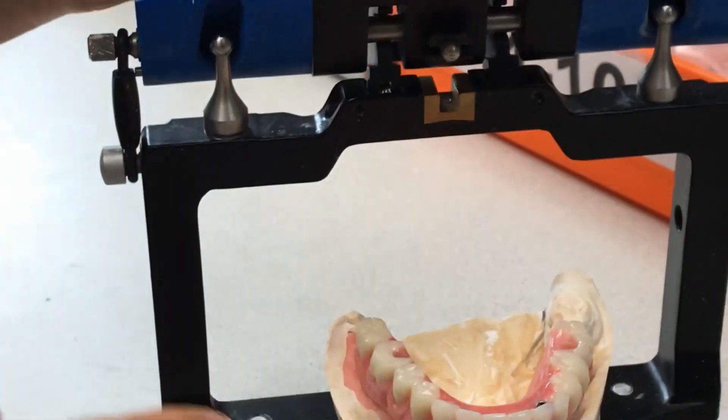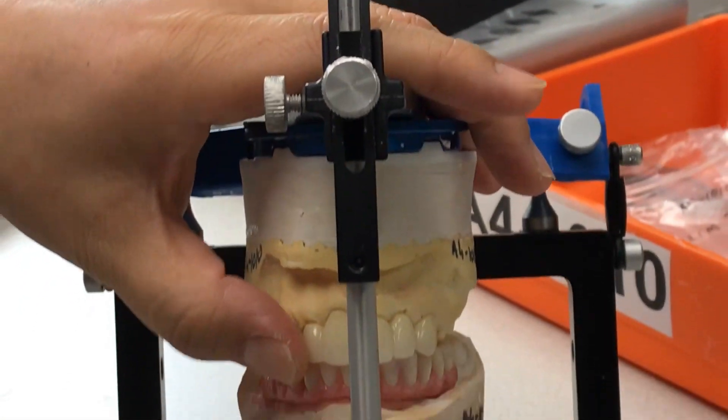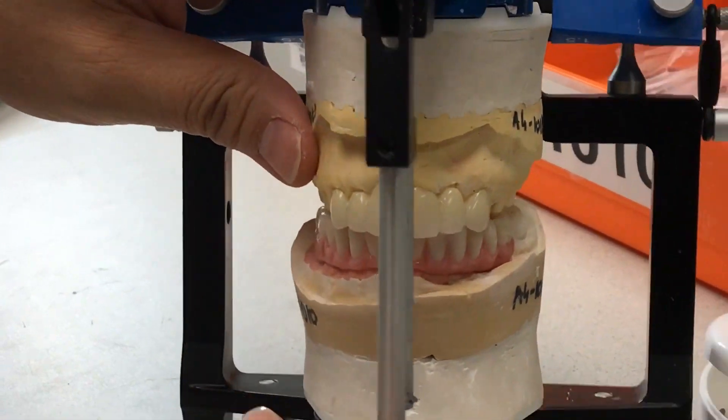We tried to bring it in as much as possible and then made the six-unit with these temps, so you get the aesthetic.